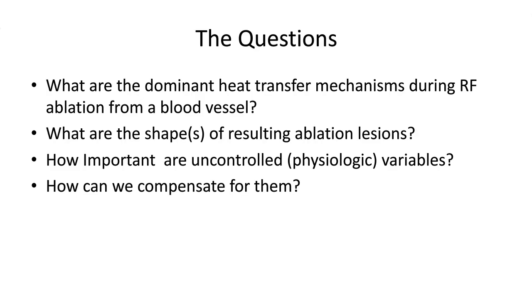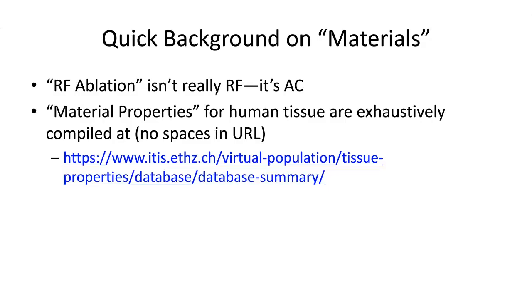Before we go to the simulation, let's fill in a couple of blanks. First, it's important to understand that what medical people call RF ablation isn't really RF in the physics sense. In COMSOL, you won't use the RF module because the frequency we use for ablation is about 400 kilohertz, which doesn't even make the bottom of the AM dial on your car radio. That gives you a wavelength of about 1 kilometer, which is quite a bit larger than most patients.